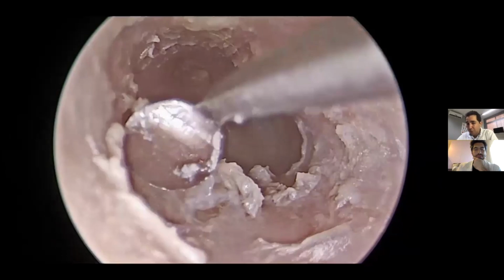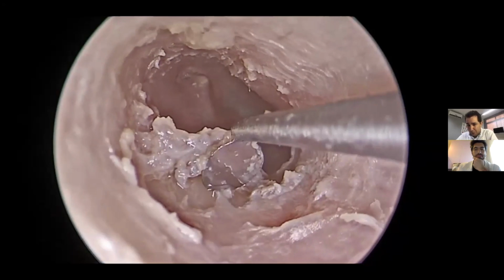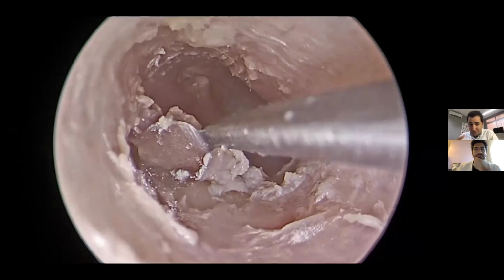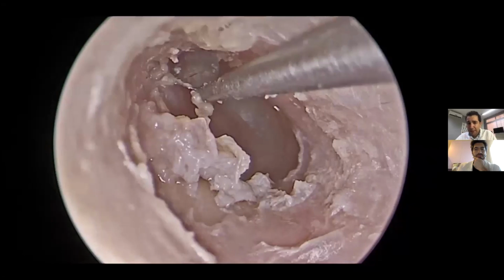And then you go, just like traditional microscopic surgery, all the way to the bone, and then you elevate this tympanomeatal flap. Since this is a cadaver, as you can see, I'm not very delicate, because I wanted it to be fast, the dissection.